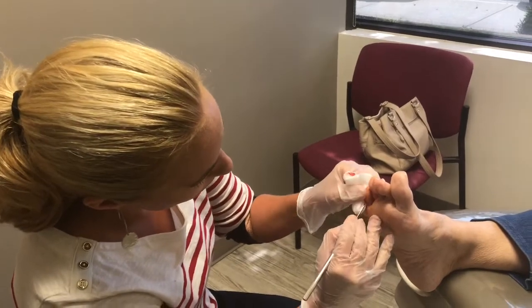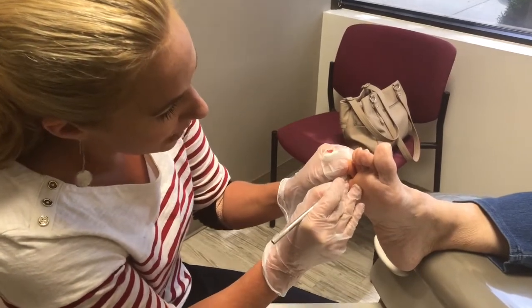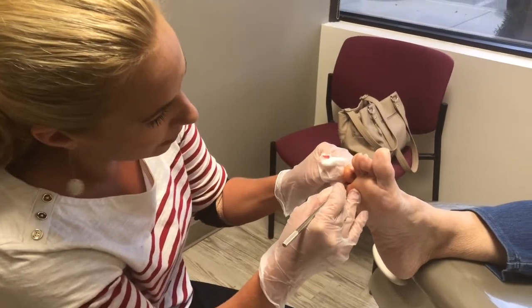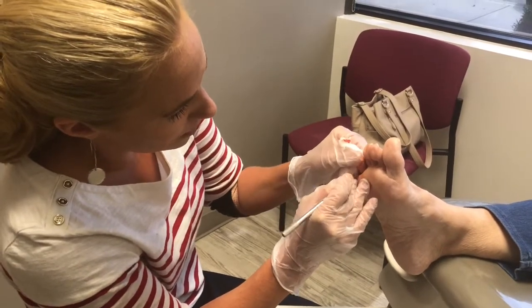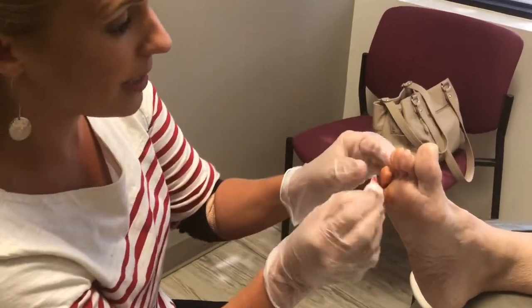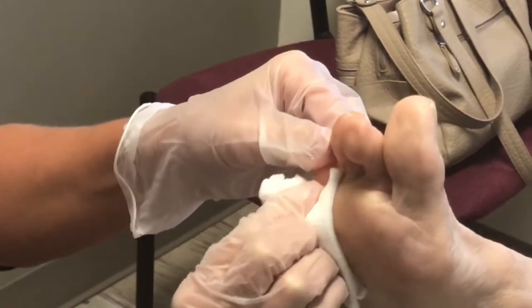So what is the downtime for recovery with the tenotomy? It's one week. What we're going to do — the incision, once I'm done, is so small, as you can see, it doesn't even require a stitch. So what she does is go home, stay off of the foot, elevate it today, and we'll put a bandage on. You don't do anything, you just leave it there. Your only job is to be a couch potato and stay off of it.